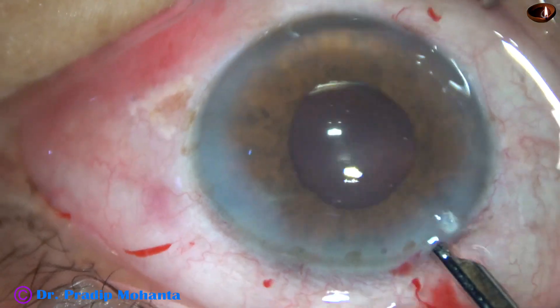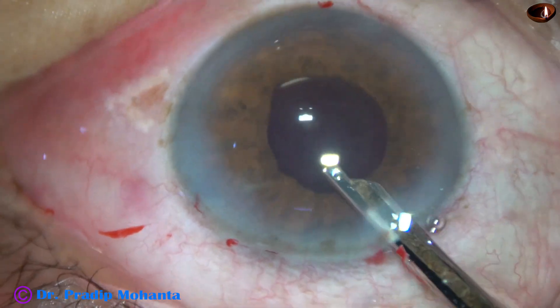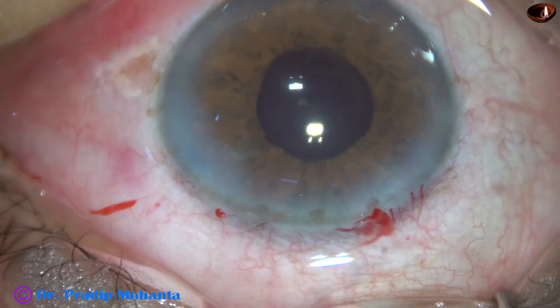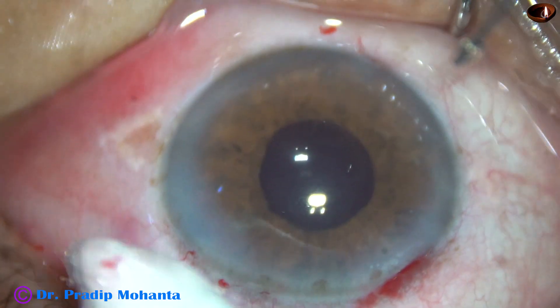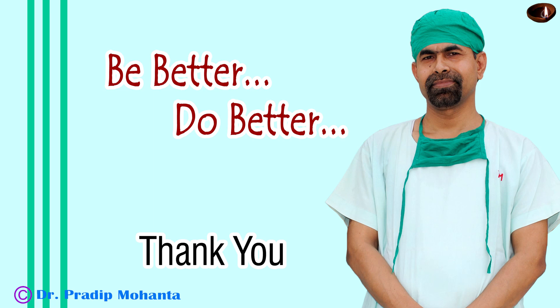This is the final lavage of the anterior chamber after closing the side port by hydrating the corneal stroma. The anterior chamber is nicely formed and integrity of the wounds is checked. A few drops of moxifloxacin are applied over the ocular surface and the case is concluded. Thank you very much for your attention. Hope this video will help you in developing your surgical skills. Be a great surgeon and serve your patients with love, respect, compassion, and great surgical competence.